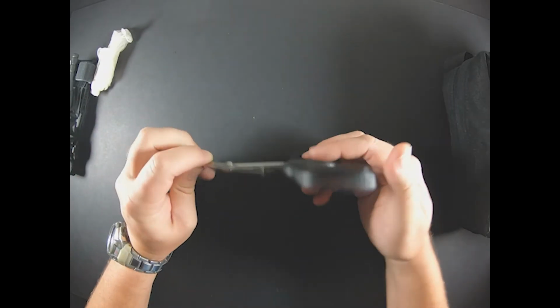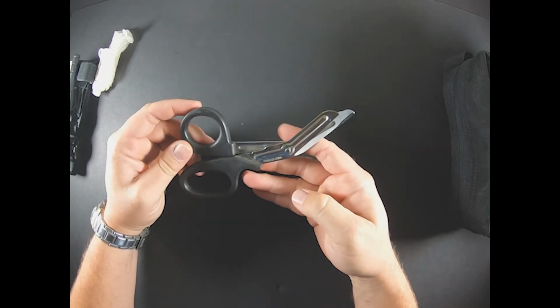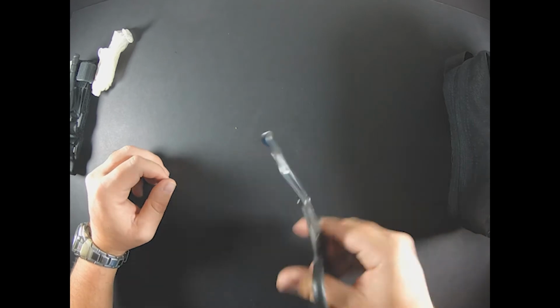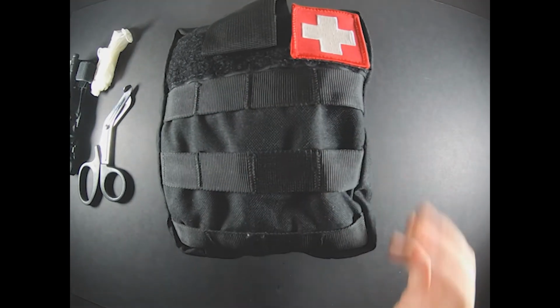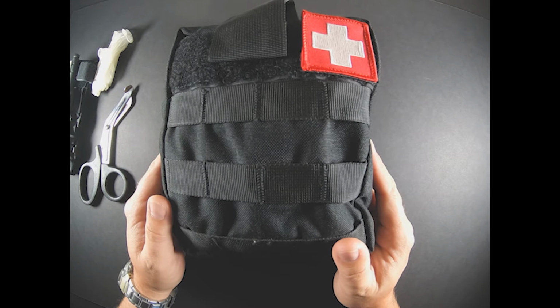Trauma shears. They don't have to really be anything fancy. They just have to be trauma shears that work. They work great. They cut right through pretty much any piece of clothing that anybody may be wearing, because what you want to do is expose the wound that you may have to work on. So that's pretty much it for the outside of the pack. Let's go to the inside.